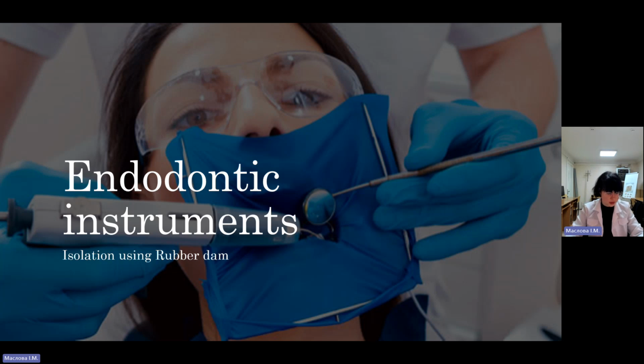Full coverage crowns are frequently not orientated to the original tooth anatomy. Study radiographs carefully prior to commencing access to see if the tooth may be rotated. Also check external root anatomy.